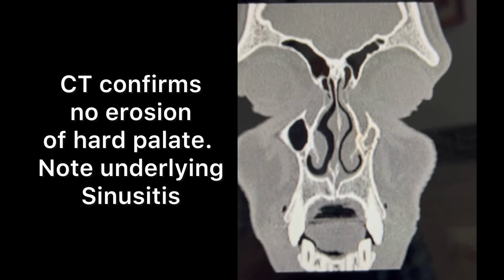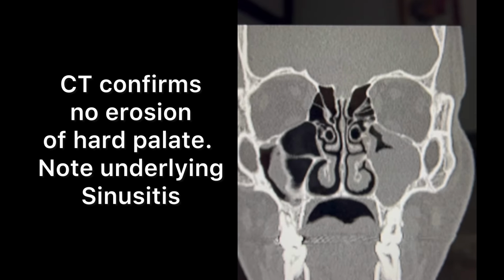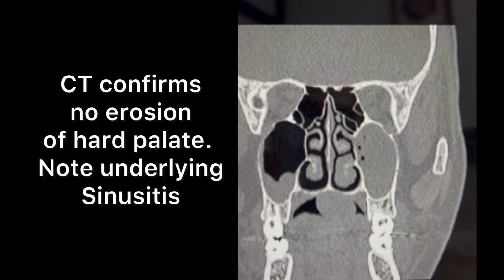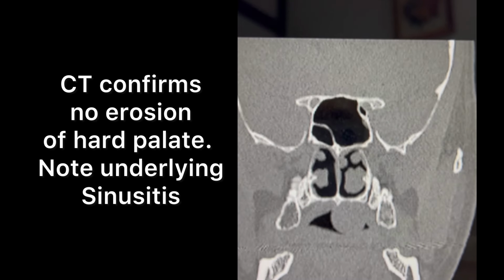A CT scan was done to confirm its location and whether there is any bony erosion, especially of the hard palate or not. CT scan revealed no erosion of the hard palate, as depicted by the arrows in this figure. Underlying sinusitis was noted.